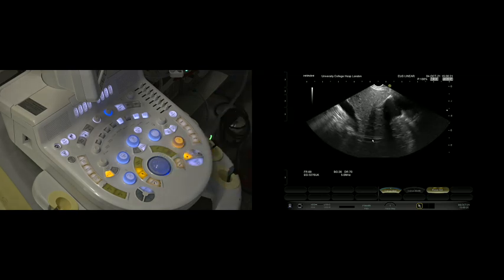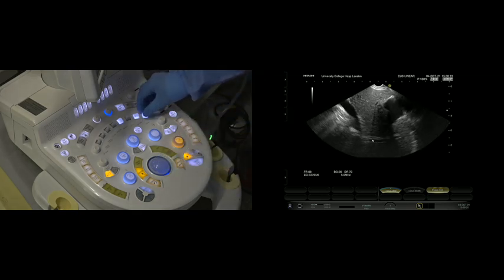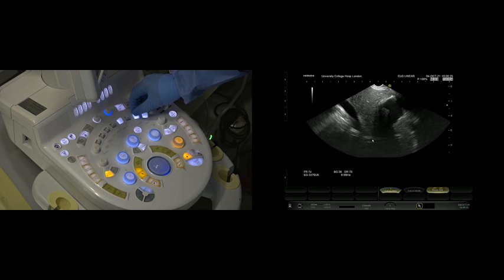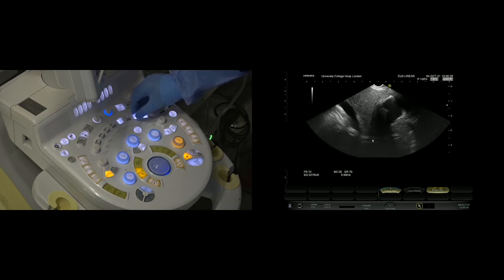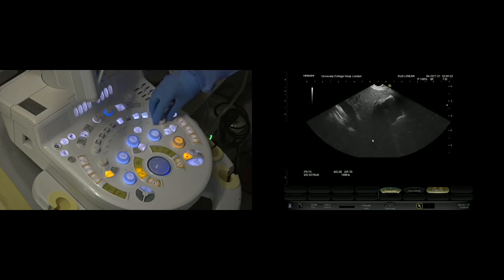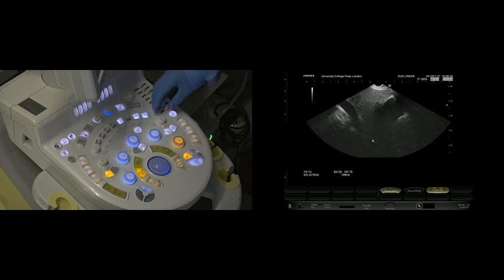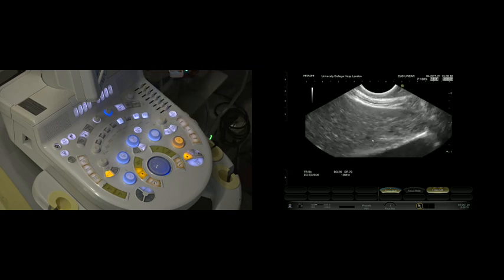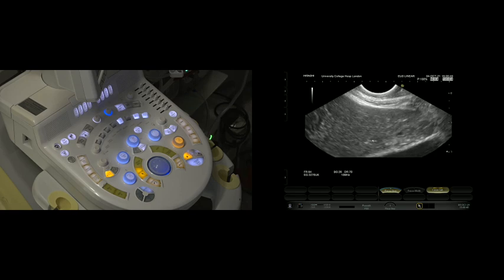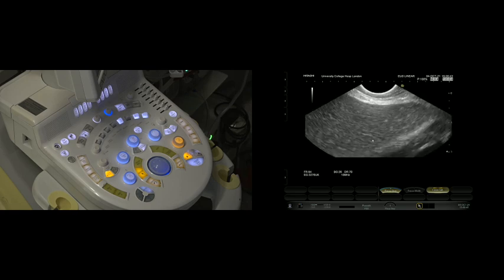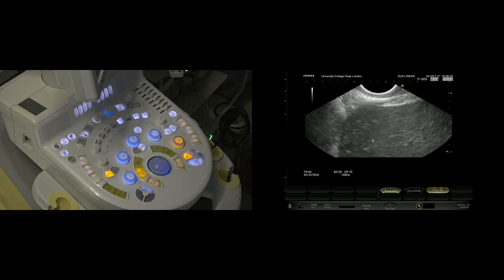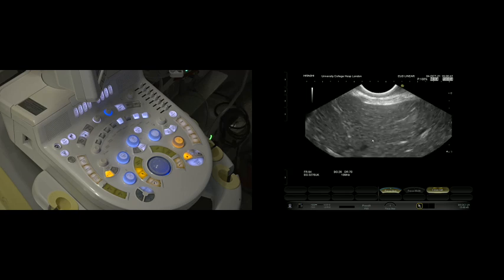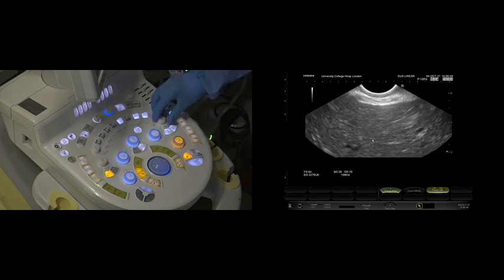You probably want about 7.5, maybe 6.5, for normal diagnostic HPB work. Again, going back to the subepithelial lesions as an example, we're going to turn the frequency right the way up and mag right the way up. Then you can't get any better resolution of the layers of the mucosa and submucosa than we've got there. I don't have an SEL to show you there.